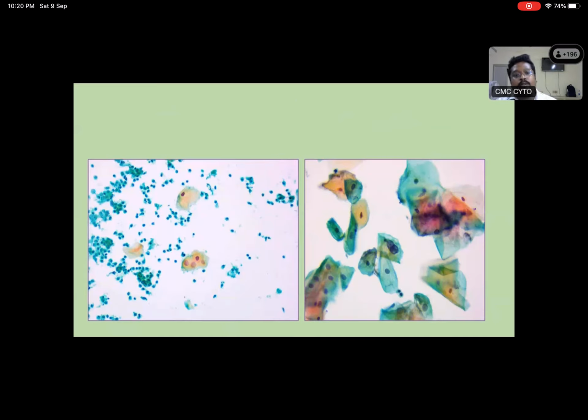Okay. So here you can see, can you see the mouse pointer? Is the mouse pointer visible? Yes. So can you use this to point the cell? These images are disappearing if I use the pointer. So I can point the cells if anybody wants to mention, I'll point the cells again.